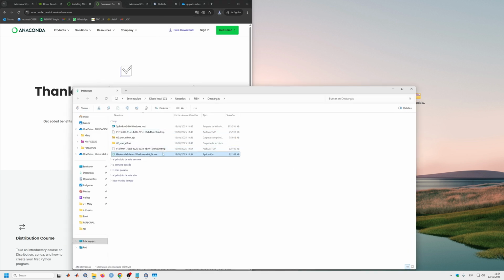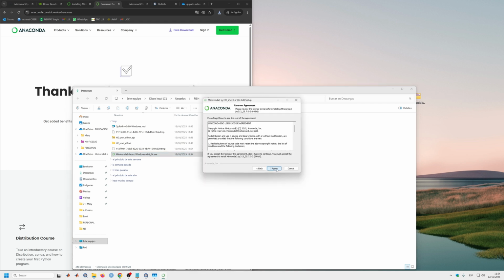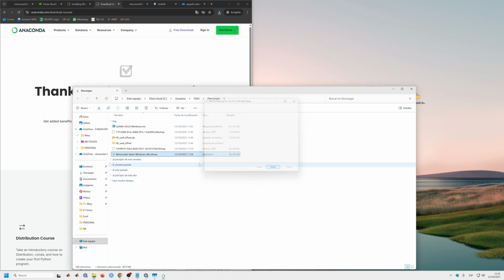Okay, so now we do next, I agree, next, and I usually put it here because nothing happens. I mean, even if it's in red, nothing is going to happen in your installation. And install. Okay, so let's finish this.